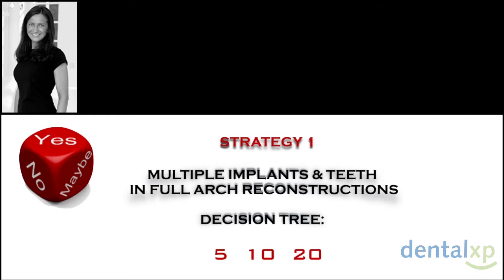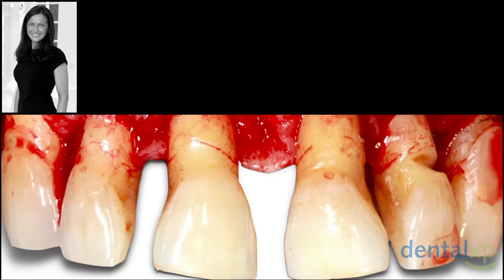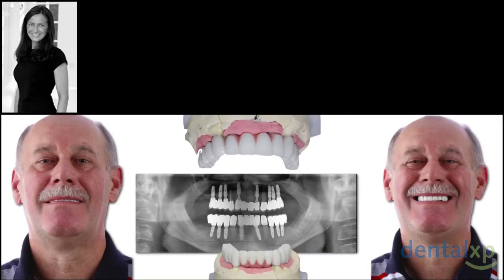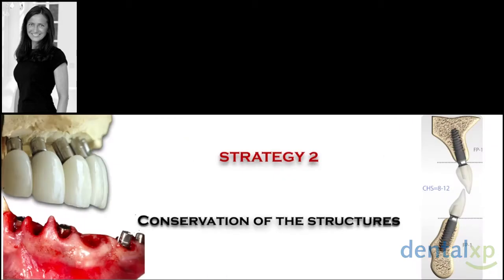If the tooth lasts 10 years after the literature or your experience, then you still leave the tooth, and after 10 years, you can, with a small procedure, remove the tooth, place an implant, and the full arch reconstruction can function continuously. Then you leave the tooth. But anything that doesn't last 5 years after the literature or your experience, you extract. So that is how you treat the patient like a full arch. So like here, the front teeth will be extracted, the canine will be treated periodontally, the way we talked about in the last minute, and this is the final situation.